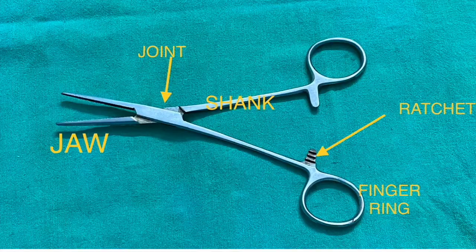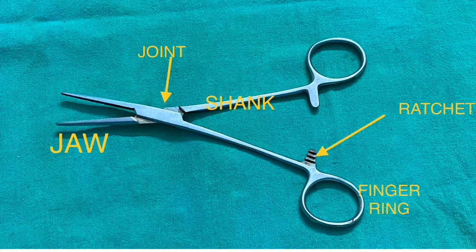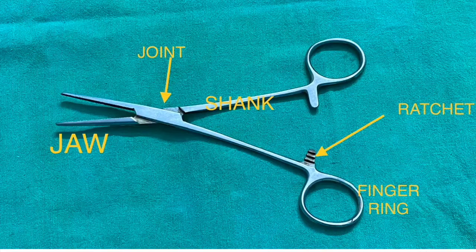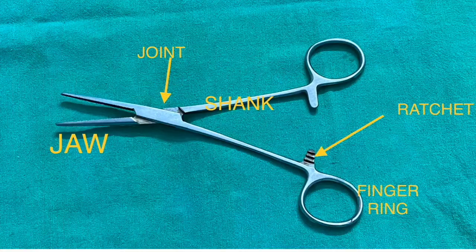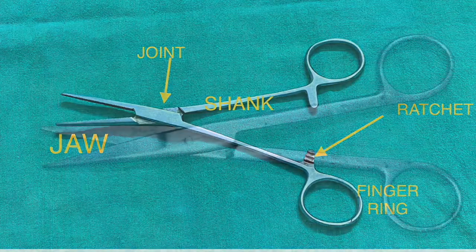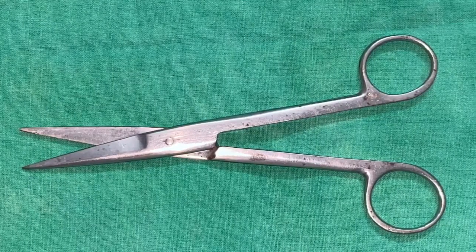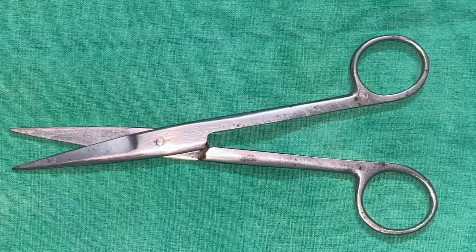You can see ratchets here — those ratchets are used to lock the instrument. The next part is the finger grip, the parts where we introduce our fingers to hold the instrument. This is a sharp instrument where both shafts are joined with a screw.